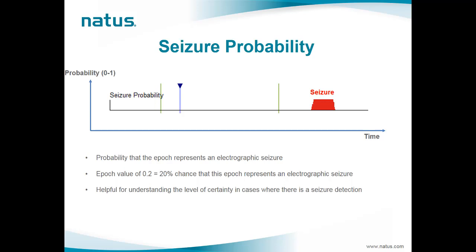The seizure probability trend provides more detail about the results of the Persyst seizure detection algorithm than the seizure detection trend. This detailed information may be relevant to users who want to see cases where there is some indication of seizure activity that does not rise to a sufficient level to be considered a seizure detection. It may also be useful for understanding the level of certainty in cases where a seizure is detected. The seizure probability trend uses a bar graph scaled so that at each one-second interval, the height of the bar represents the probability that the interval represents an electrographic seizure.